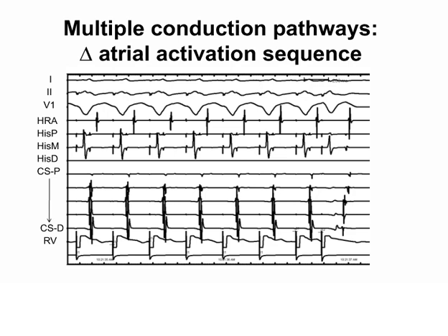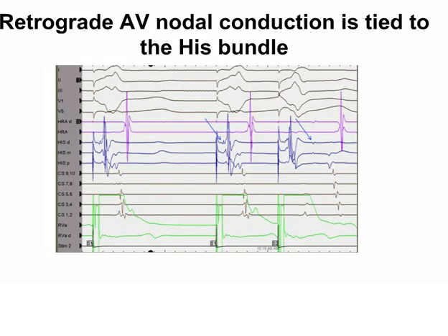to distal coronary sinus. And then suddenly, when you put in a premature after the drive, there's a sudden change in the activation sequence. So this would end the activation timing. The VA time gets longer, and the VA sequence changes. Now the His is later, and the distal CS is early. So this, again, gives you a clue that you may be looking at an accessory pathway. And you may need to do those kinds of premature stimuli to bring out differences.